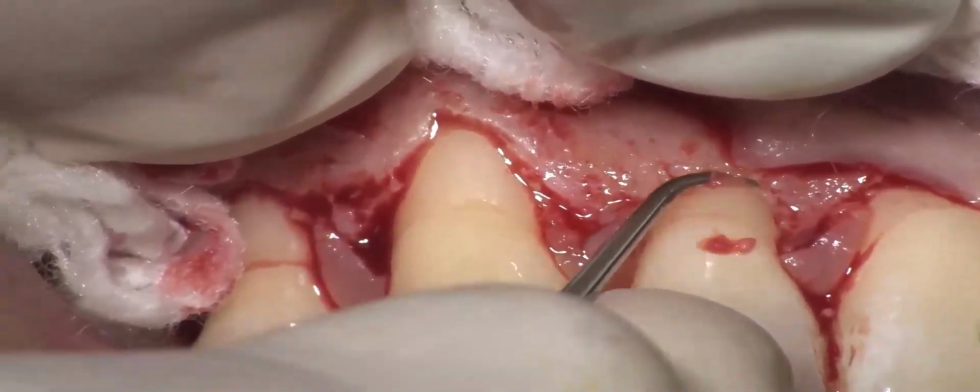Okay, now root planing has been completed. We can see the whole area.